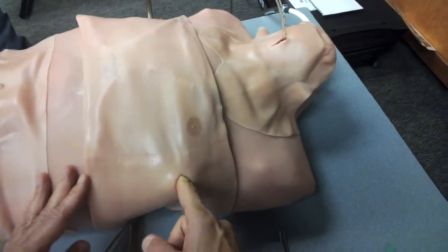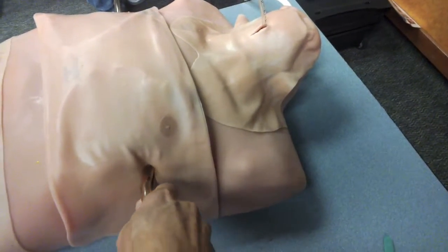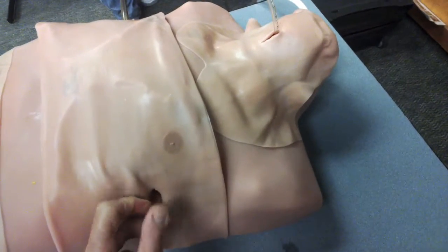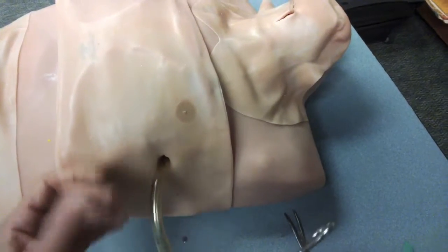You also want to make sure that you're above the diaphragm and not below the diaphragm. This is the fourth to fifth intercostal space — find your space, and once you are in, you will be able to advance it easily where you want it, normally 10 to 12 centimeters, depending on the size of the patient.